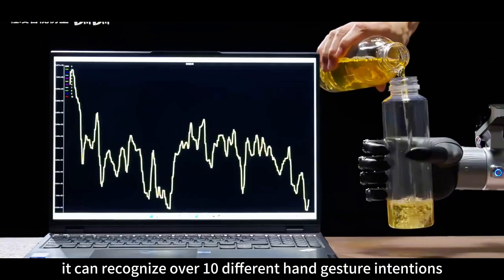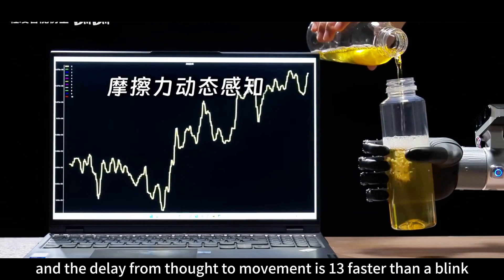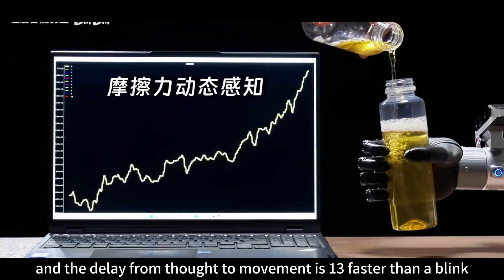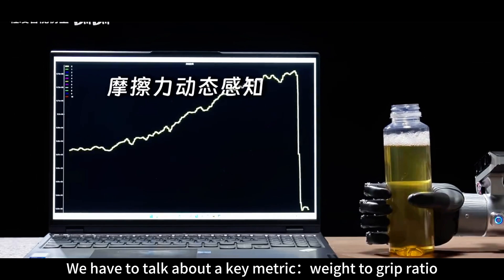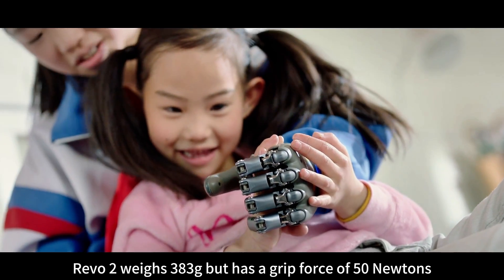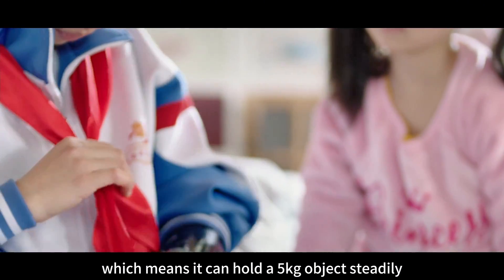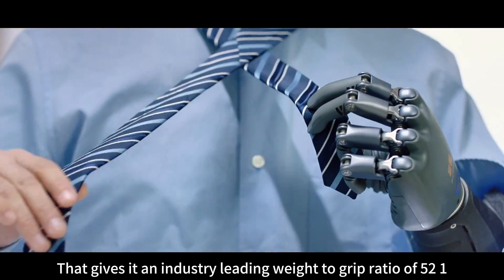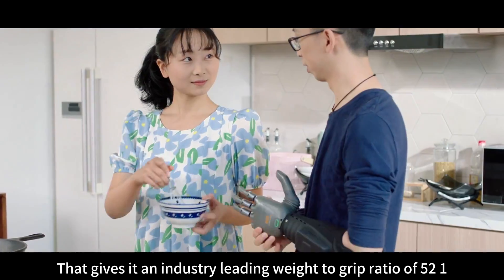It can recognize over 10 different hand gesture intentions, and the delay from thought to movement is one-third faster than a blink. A key metric is the weight-to-grip ratio. Revo 2 weighs 383 grams but has a grip force of 50 Newtons, meaning it can hold a 5-kilogram object steadily — giving it an industry-leading weight-to-grip ratio of 52 to 1.